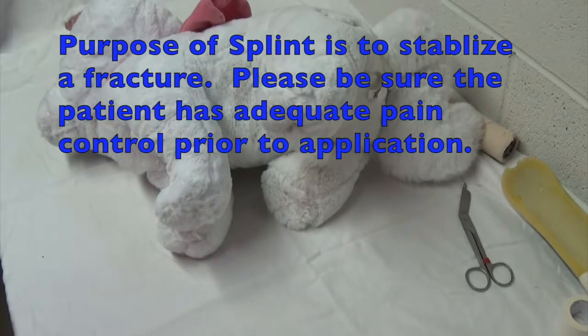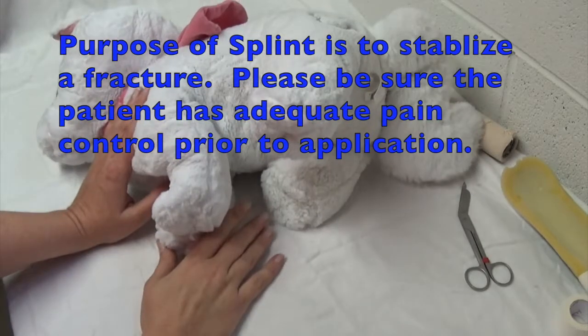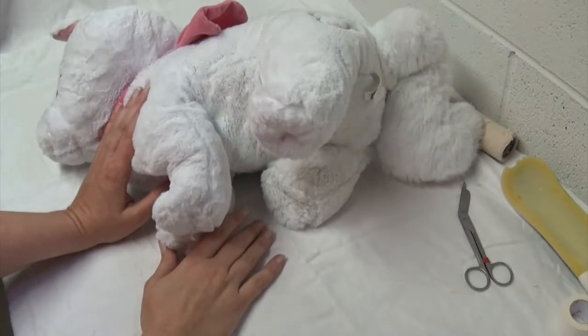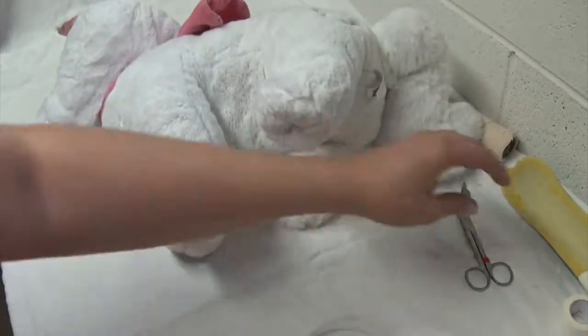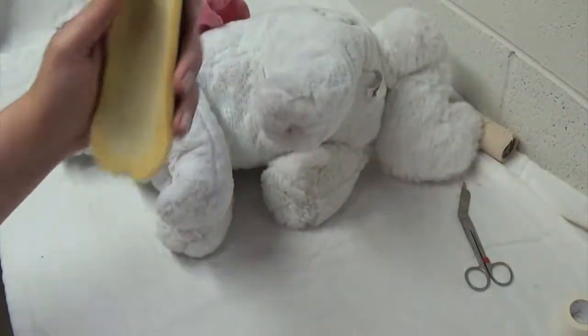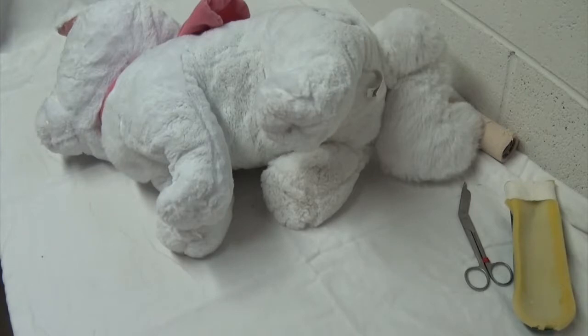For the application of the spoon splint or any splint, please make sure the patient has adequate pain medication on board — hopefully they're sedated or under anesthesia. We're going to be doing the spoon splint, and it's going to be very similar to a modified Robert Jones, just incorporating the splint into it.